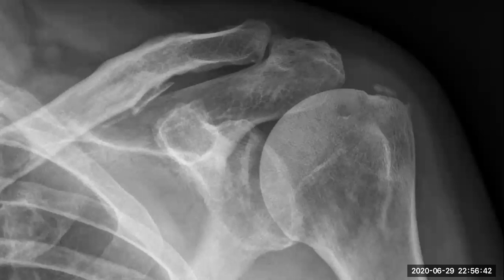Okay, what is this? Apart from the degenerative changes of the acromioclavicular joint. Okay, very good. Linear calcification. Maybe ligamentous calcification, or deposition of crystals. What is in this area? It can be a normal variant in this area.